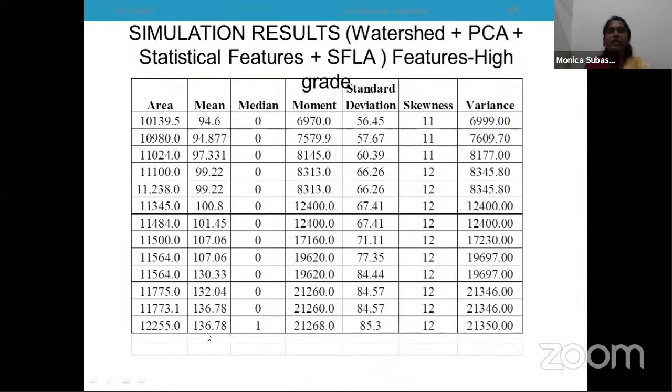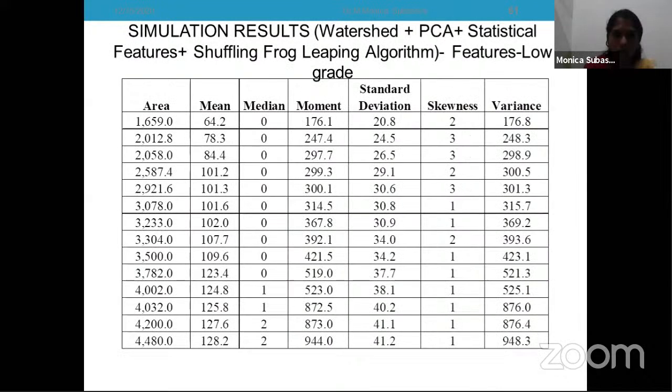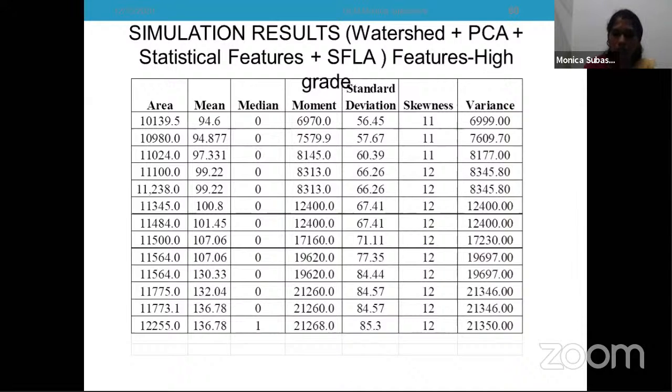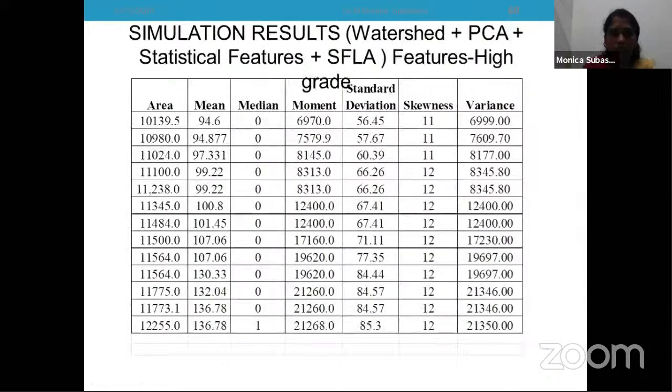These are all known as features. I applied feature extraction techniques to extract features. What was the feature extraction? GLCM was the feature extraction technique I applied. Now, I selected one particular feature. Which one? The area. You can see considerable difference only in area.